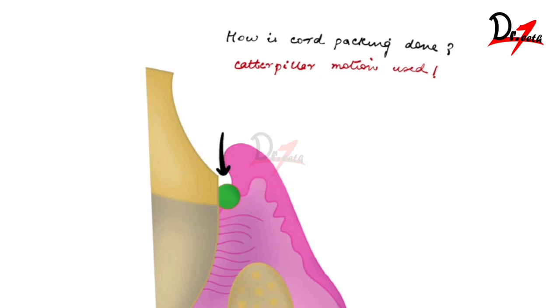Here we have our cord. Now we start packing the cord interdentally first. So tuck it interdentally because this area has a lot more space so that the cord can go inside and stay there.